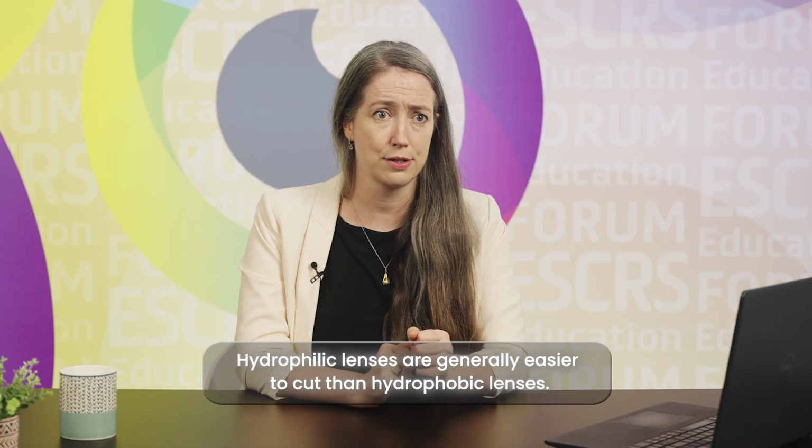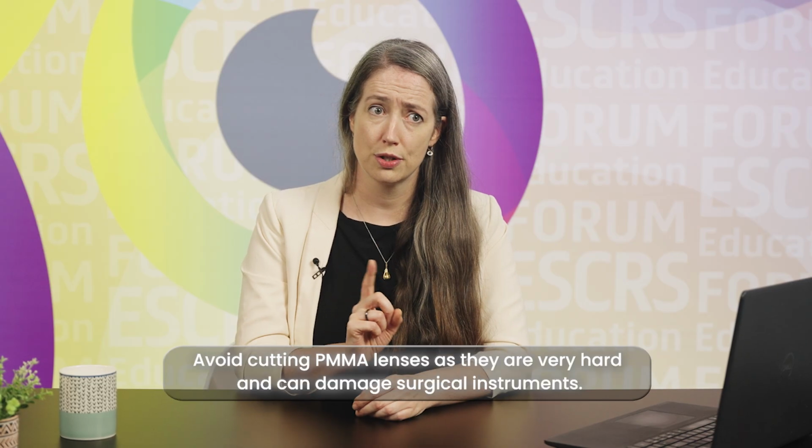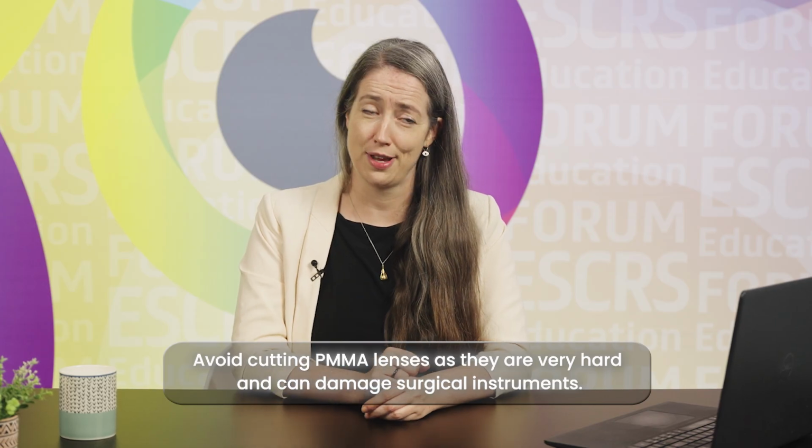The third thing is you need to know the lens material and shape. Lenses cut differently. Hydrophilic lenses cut more easily than hydrophobic lenses. Silicone lenses cut very easily. And I'll tell you, don't cut a PMMA lens at all. I've tried it once, I broke my scissors and the lens remained intact. So be very aware in identifying what lens was placed if you can, and be prepared to cut or fold the lens in the eye and have a very safe explantation.